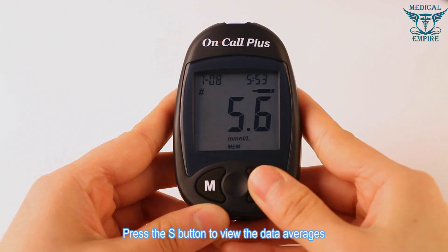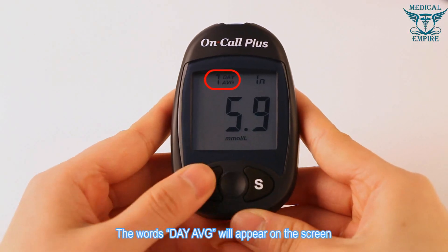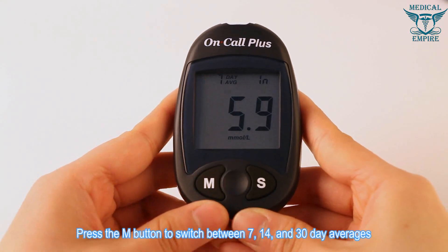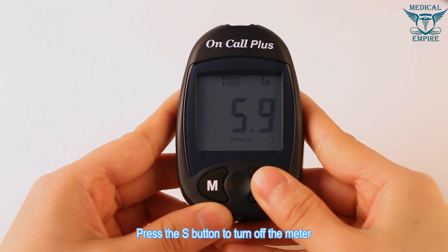Press the S button to view data averages. The words 'day average' will appear on the screen. Press the M button to switch between 7, 14, and 30-day averages. Press the S button to turn off the meter.